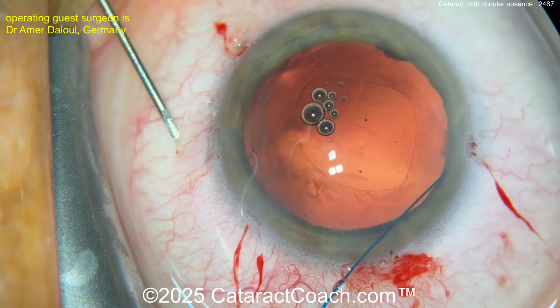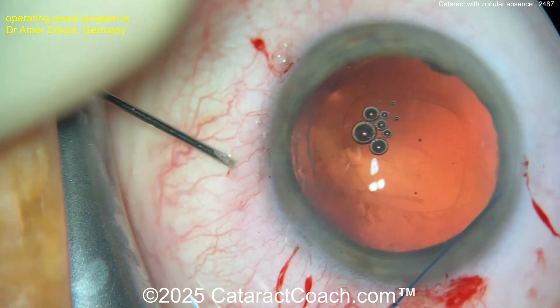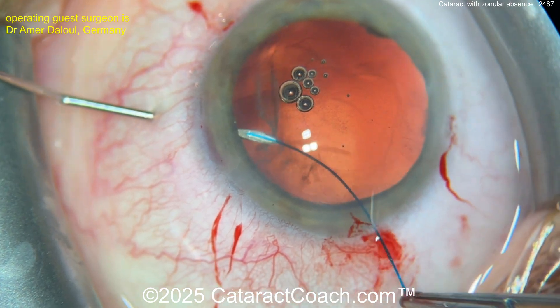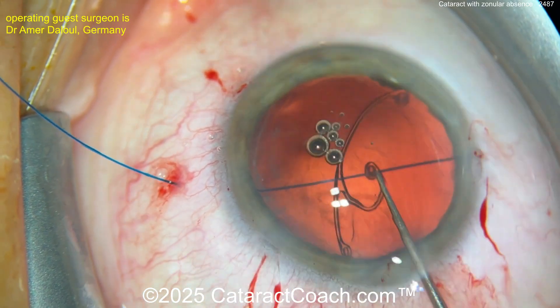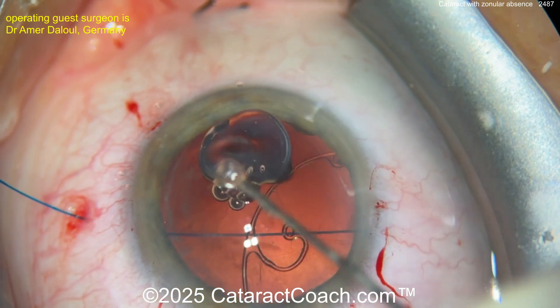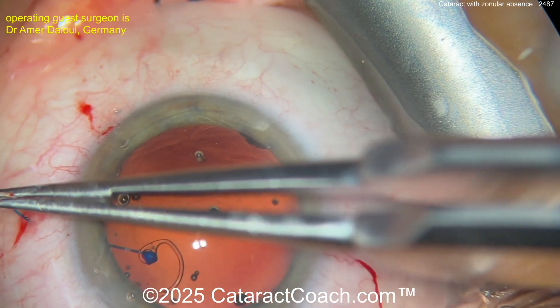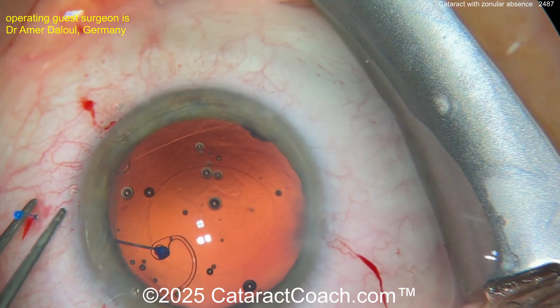Now what are you going to do to stabilize it? Looks like a small gauge needle going in there, maybe one and a half to two millimeters behind the limbus, and passing in what looks like a prolene suture — maybe a belt-loop type technique. Maybe putting in a capsular tension segment — there it is, there's the CTS, we guessed it! Cauterize the other end perhaps to leave a flange on there. More viscoelastic is always good — there's the flange on the other end, nicely done.